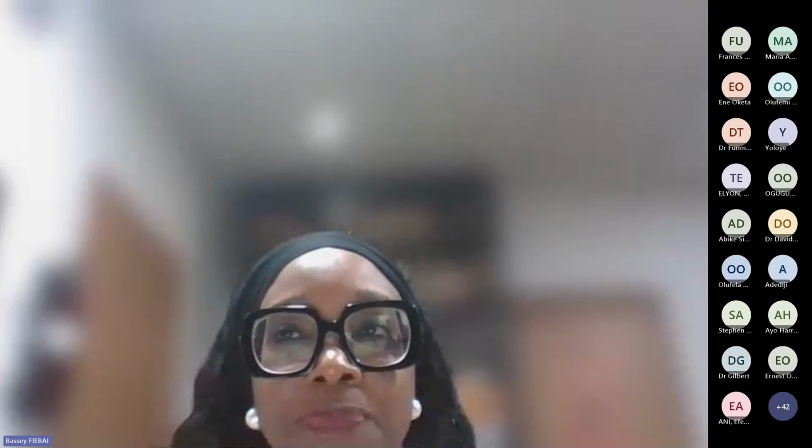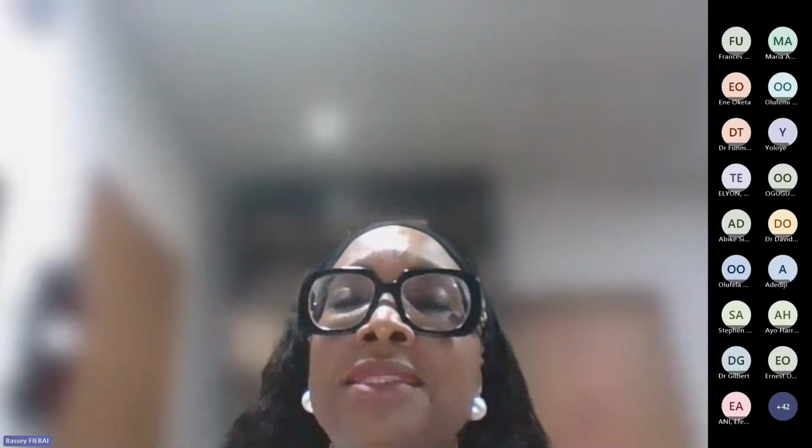First of all, if you look at the echo texture of the mass, you will see that there are some areas that will be very hyperechoic, extremely bright. And if you look at the A-scan spike over that area, you will notice that it is very bright. So some areas may not have very high A-scan spikes still in that mass, but you'll see some areas that have very high spikes. So the mass may somewhat be echogenic in its echographic interface.